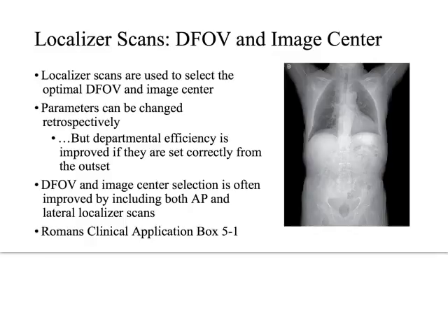So when we think about them as they relate to display field of view, okay, so here's a localizer that was probably taken in the AP direction. And so like she illustrates in the textbook, the tube is directly above the patient, the detector array is beneath the patient, and what's happened to acquire this image is the machine has just moved the patient through the gantry, right?